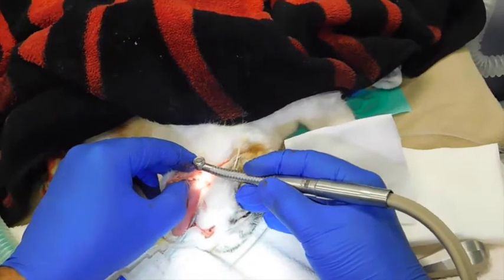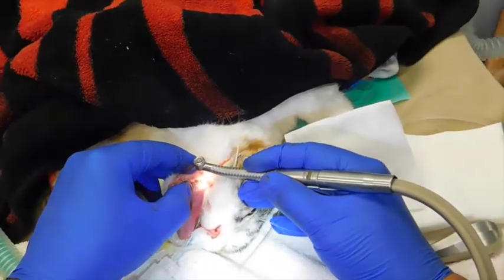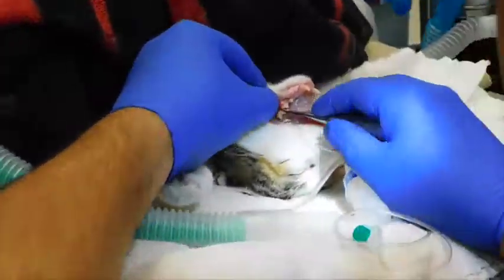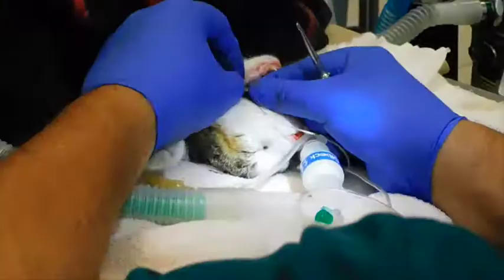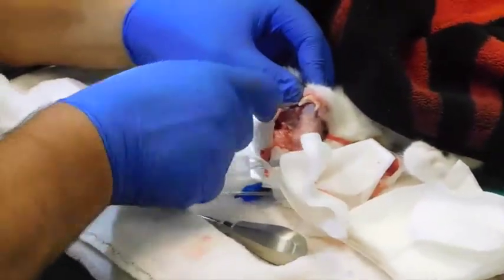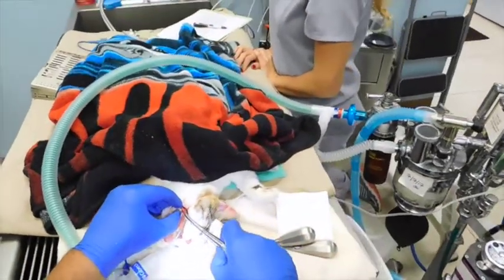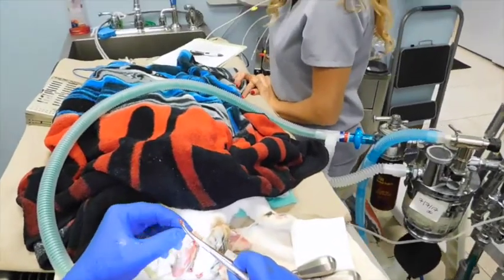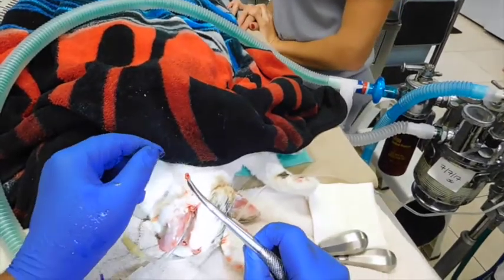We're going to cut the tooth in half. After the root is drilled around and released, we can see it. We can see all the periodontal disease here.